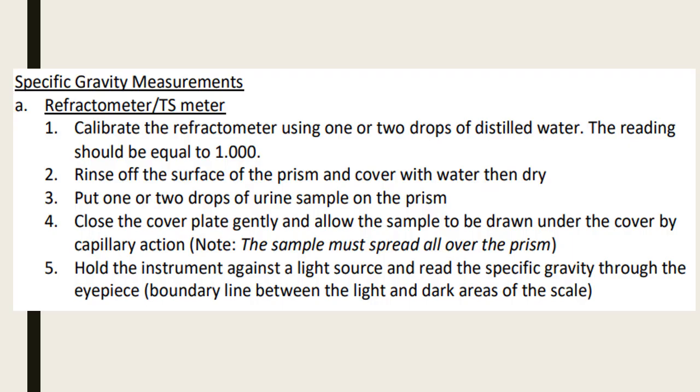Okay, and so with this, we're going to take a look at your specific gravity. So what does specific gravity mean? Again, it is defined as the density of a solution compared with the density of a similar volume of water at a similar temperature.